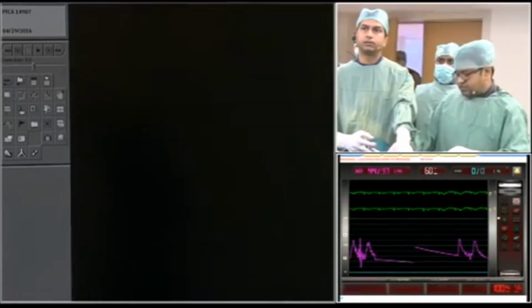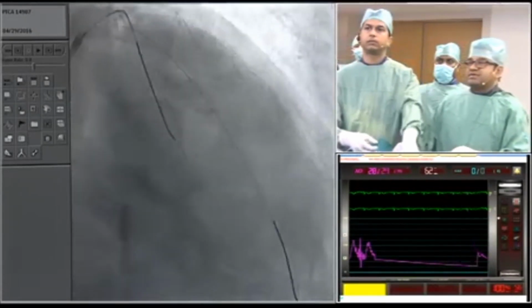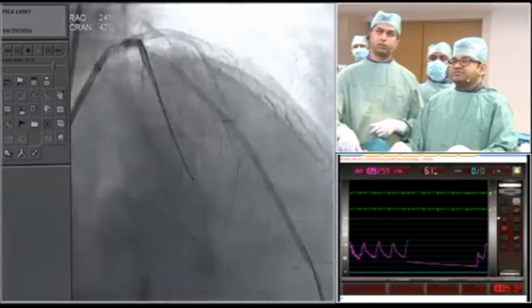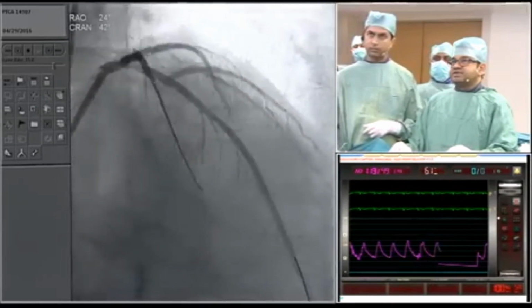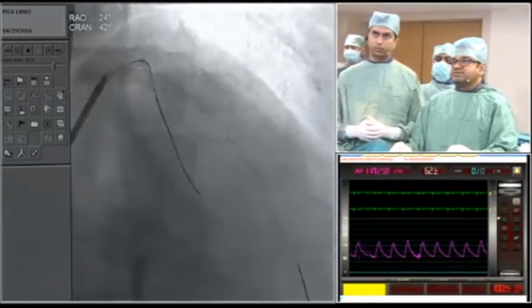We have given some vasodilators. I honestly wouldn't choose a BVS here, because in the end you don't have the issue of surgery in the future at this level. One issue for me that is nice with the BVS is the distal lesions, because then they disappear and the surgeon can eventually operate there.